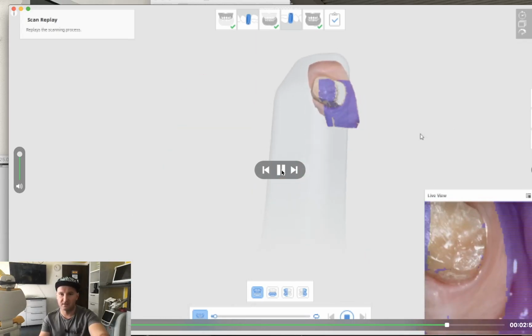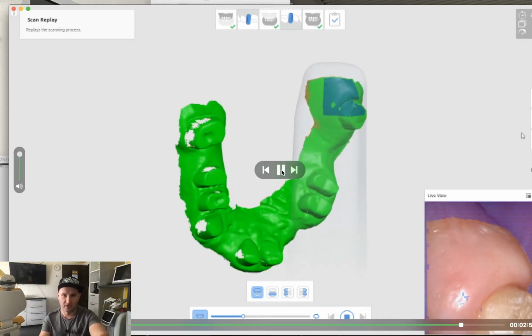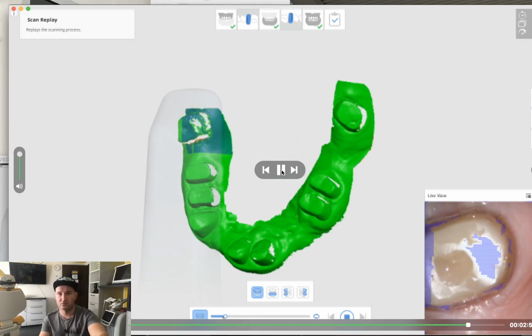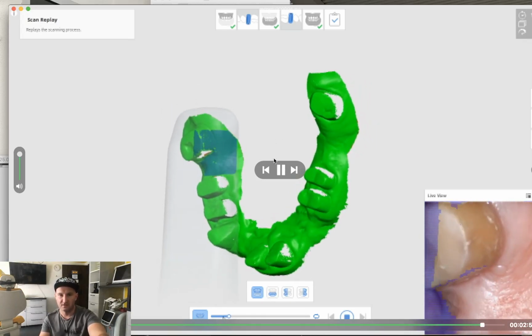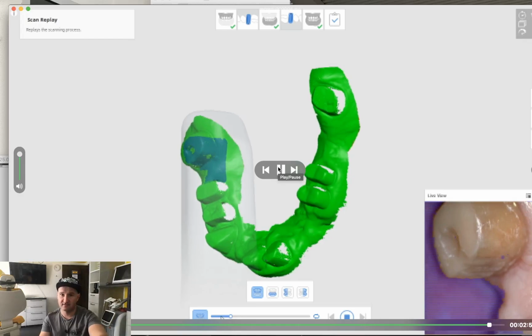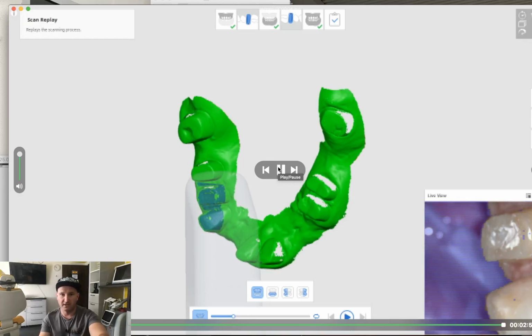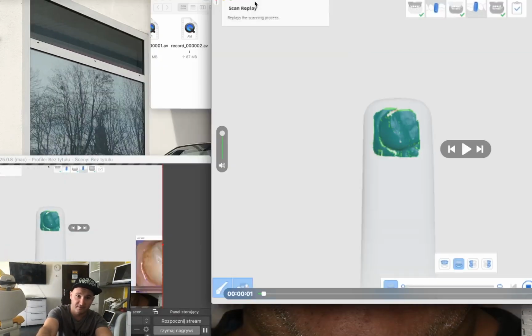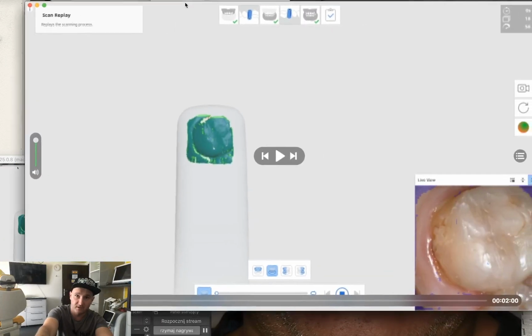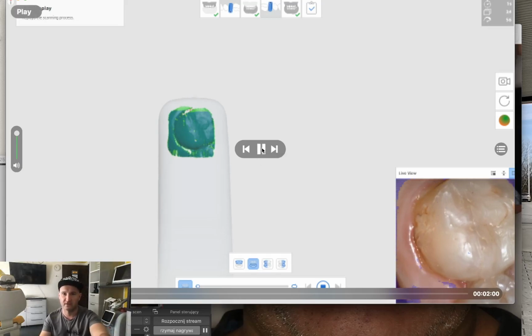But it does not mean that you need to stay on the scanned area for much longer. It means that if you want to get your image green, your scanner needs to see the area from at least 2 different angles. When it is seen from 2 different angles, the program will be able to generate a proper 3D image. If it is not, the program may not be able to generate a good image.